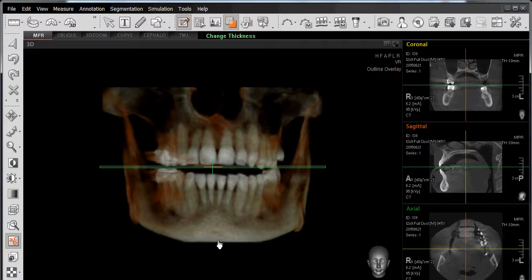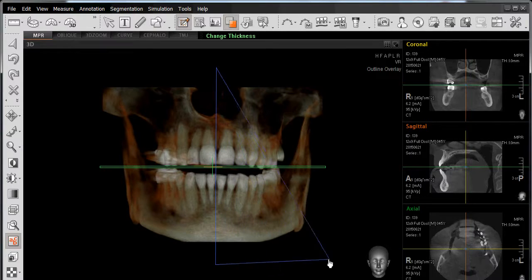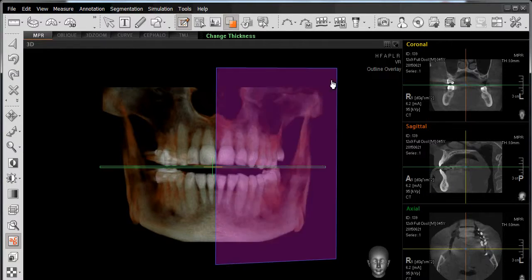We'll go ahead and work with our 3D rendering here, and we'll do a sectional cut where we're going to run a line through the midline and remove the entire left hand side of our arch. I'll left click at the top of my scan, left click once at the bottom of my scan, left click over here, and then left click in the upper right hand corner here.